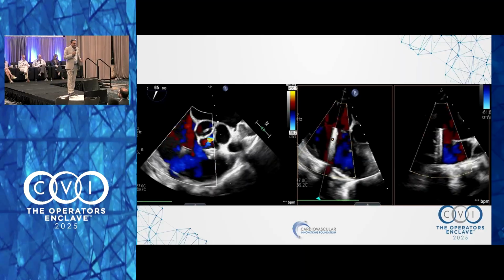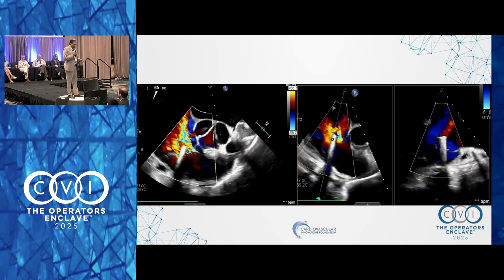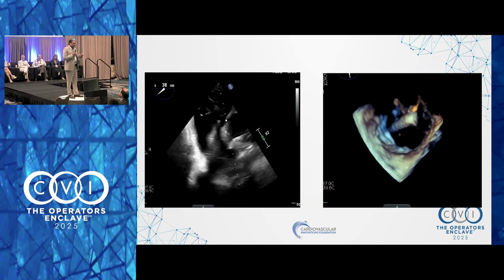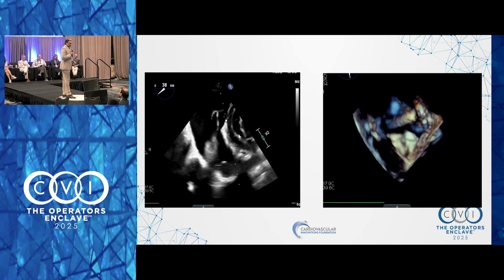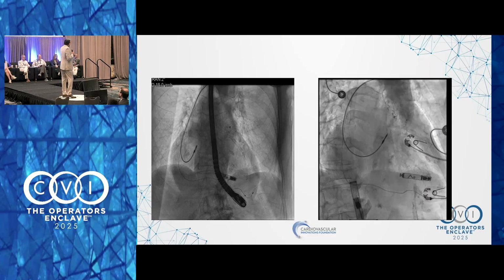So yes, this is what I had. I finally told him, and he was out of town, and so we actually fixed this on the table. You can see that it's kind of manipulated. Now it's really on that septal leaflet, right? So the torrential TR was just tons. Fixed by moving it around? Yeah.